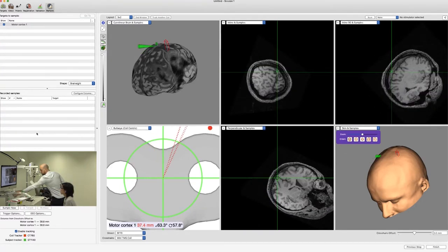I'm just going to pull this a little bit closer. So we've got one problem here where the BNC cable is very, very short. We're going to ship you a new one which is longer, because obviously you wouldn't normally have BrainSight and the I.O. box and then the TMS machine right next to each other.